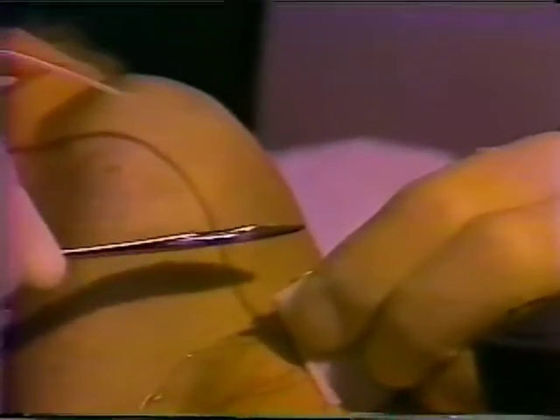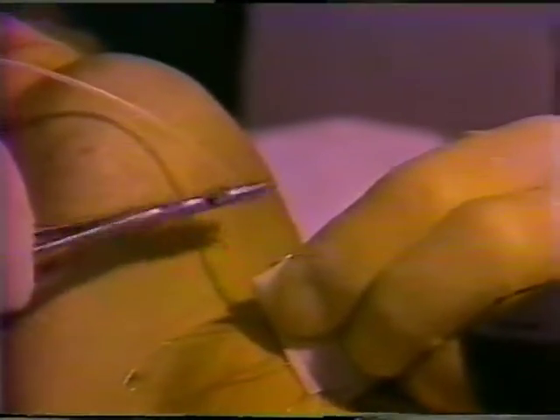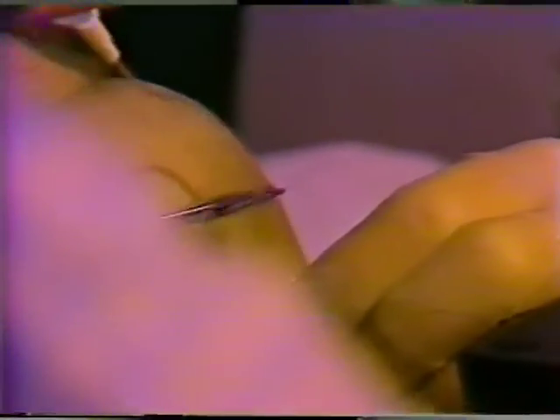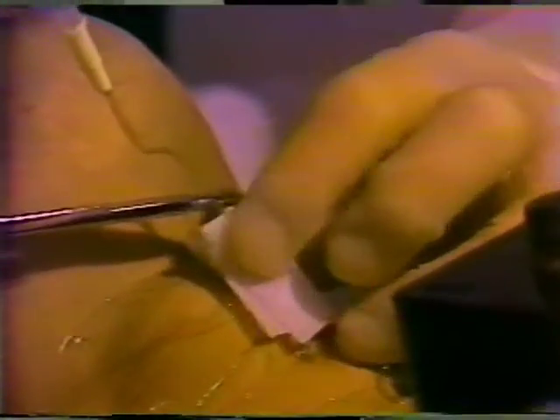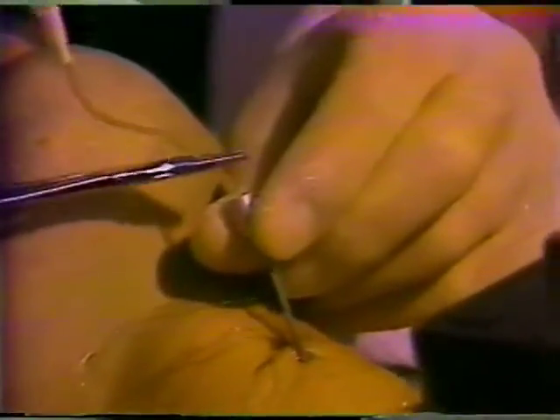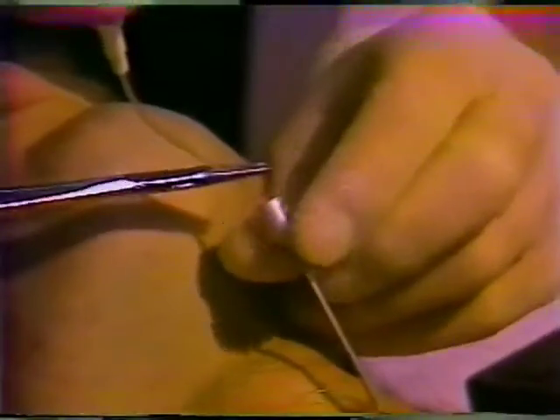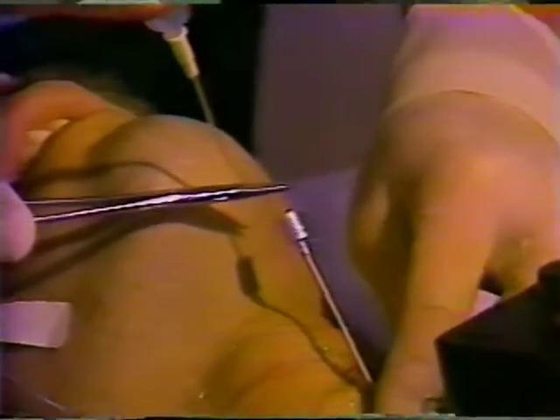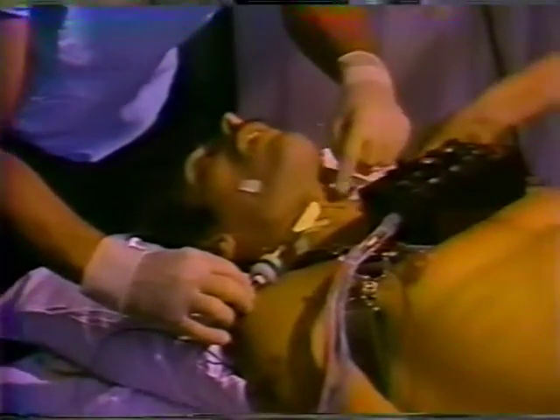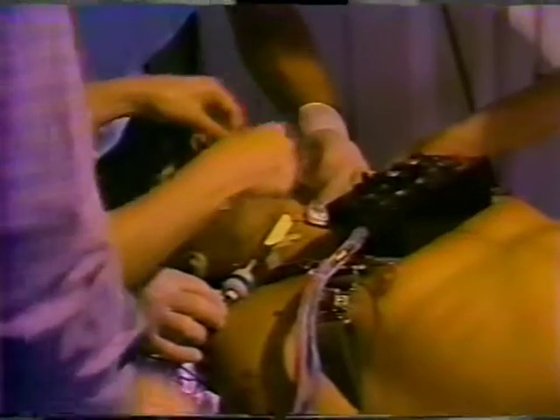Next, a small catheter is threaded through the needle approximately five inches down the trachea. The needle is then withdrawn, leaving the catheter in place. The catheter is then attached to a pressure transducer taped to the subject's shoulder. The catheter is considered clear when the subject's syllable repetition creates both a DC shift with an AC ripple on the oscilloscopic trace.